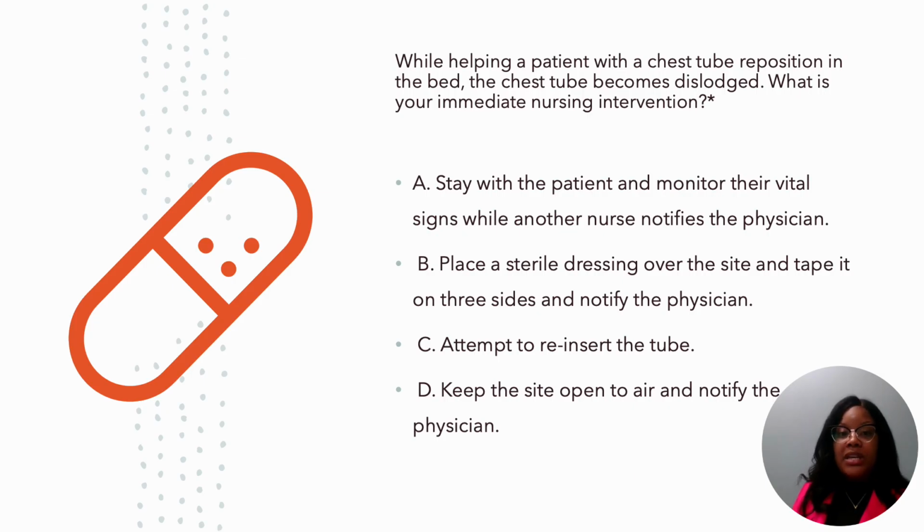So if you chose B, you are correct. You want to place a sterile dressing over the site and tape it on 3 sides and notify the physician.